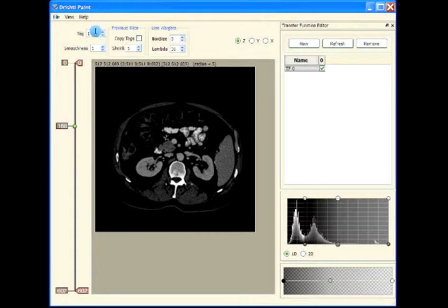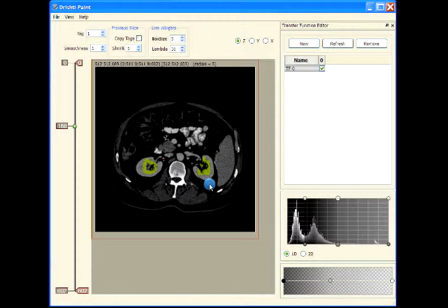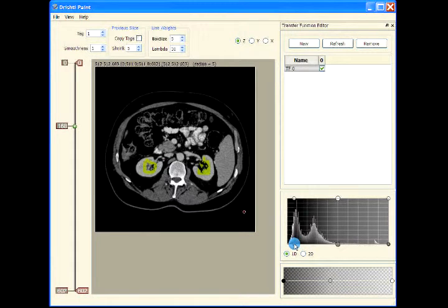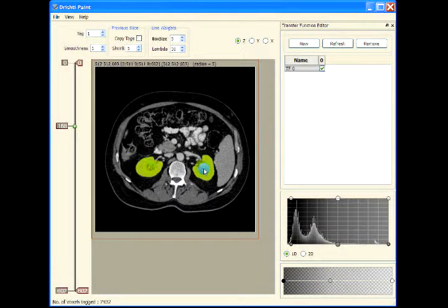Let's use tag one. We can either segment each kidney separately or segment both kidneys together. I've marked out the portion — let me include the inner part as well. I've got it here and here. Apply tag.